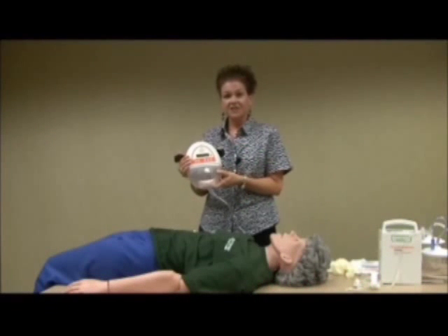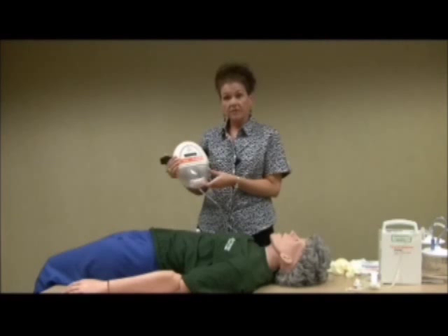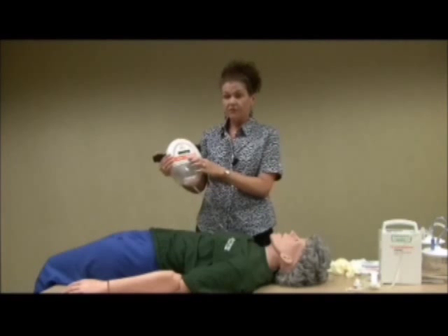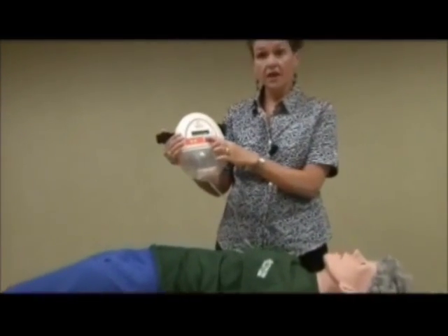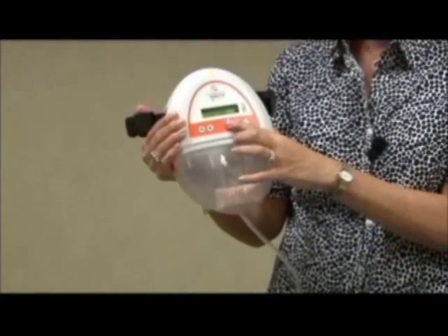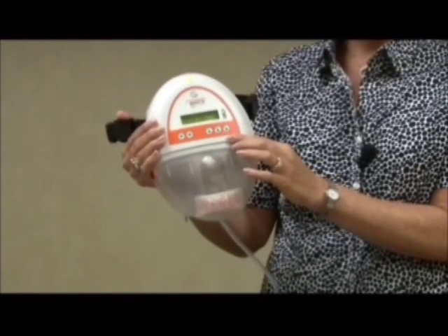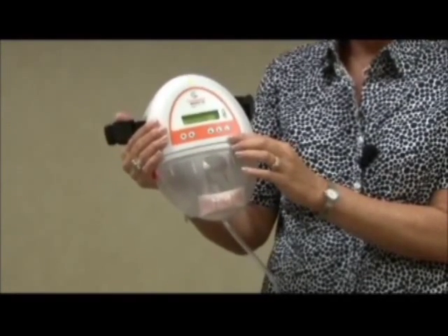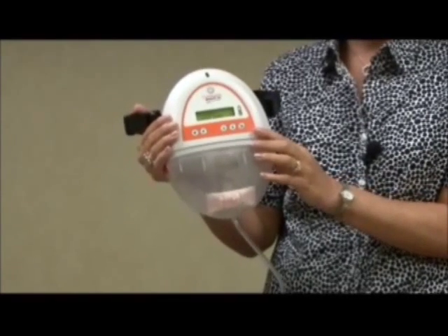Now that you're ready to change the canister on your negative pressure wound therapy device, you'll need to do a couple of things. First off, if your machine has locked out, which will be indicated with a blue light, you'll need to press and hold the button until the blue light turns off. Once the blue light is off, you'll need to turn the machine off by pressing the button that is furthest to the right. Your machine is now turned off.